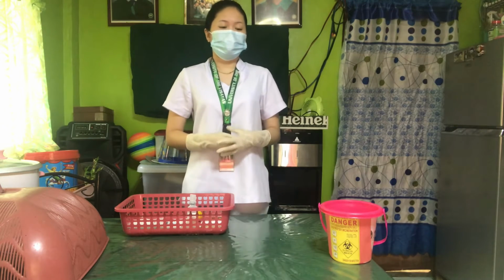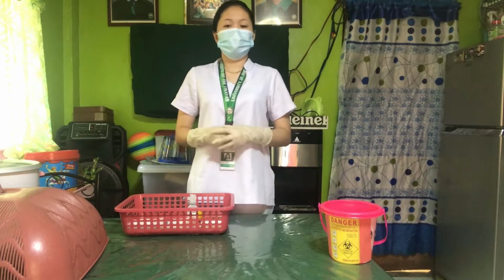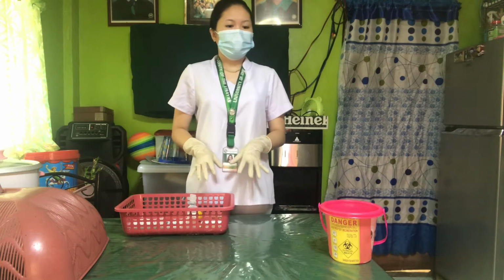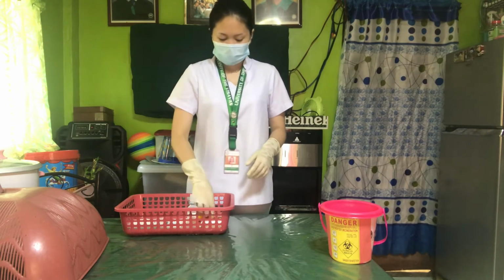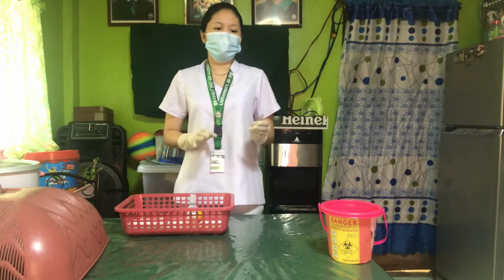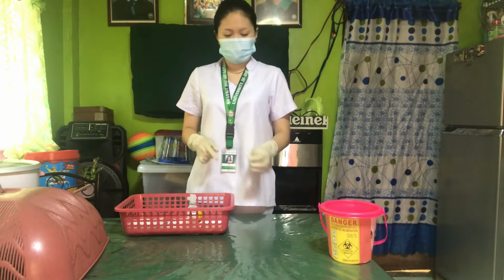Let's proceed to the next step, which is prepare the medication ampule for drug withdrawal. Preparing the medication will save time and be able to withdraw the drug properly. So we prepare here the ampule, and I am going to clean and disinfect the neck of the ampule using the alcohol swab.